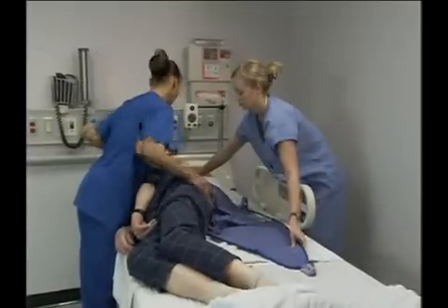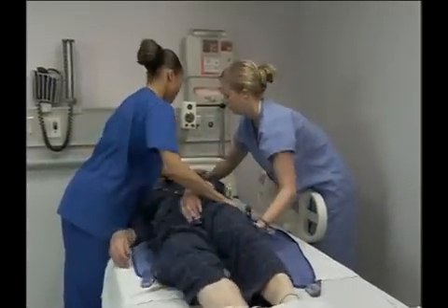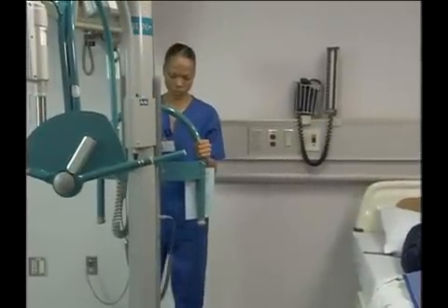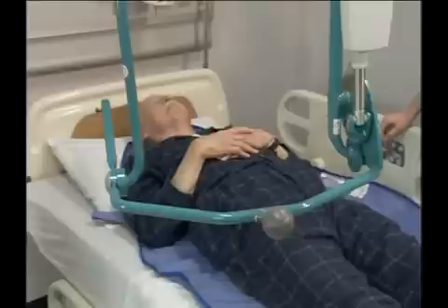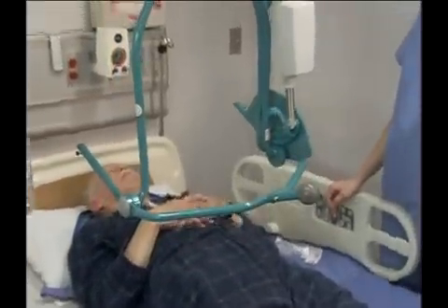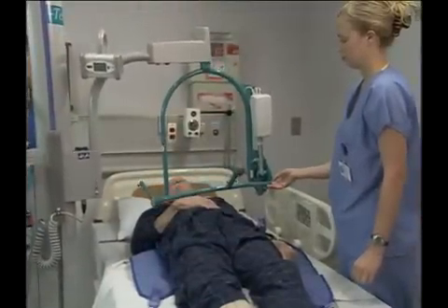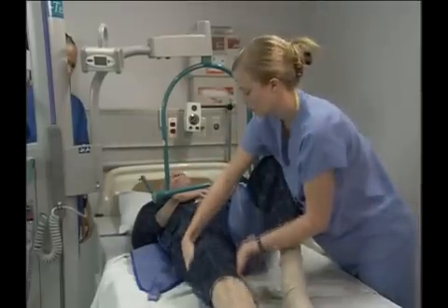person, positioning the sling between shoulders and knees. The sling's lower edge should be under the person's knees. Raise the lift so it can be moved over the person. Move the lift into position over the person. Then lock the wheels. Attach the sling to the swivel bar.